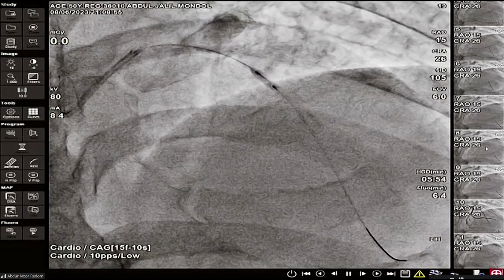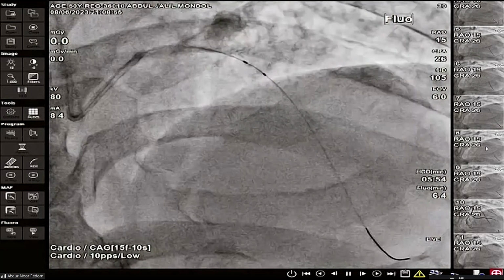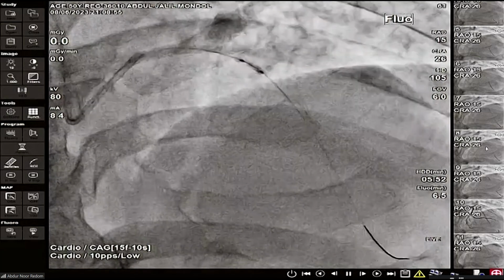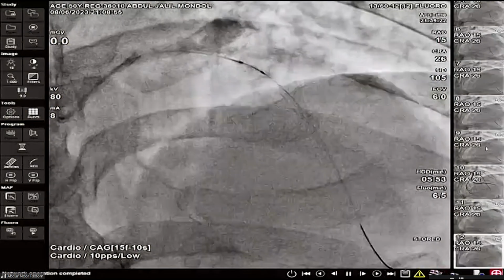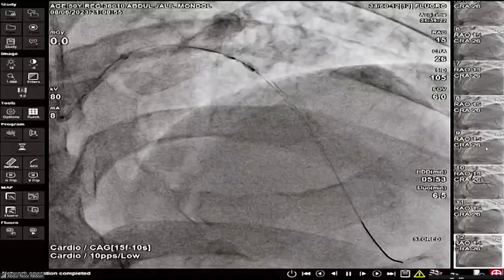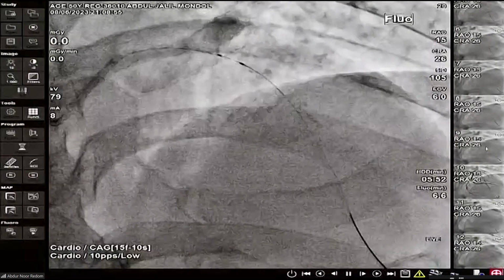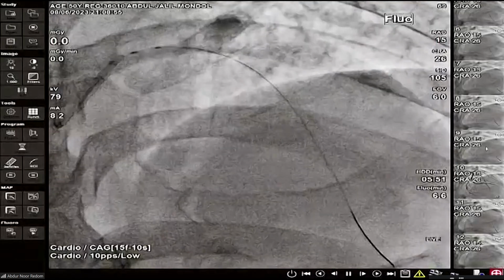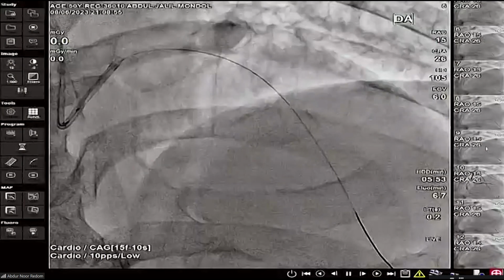Sandeep, what is your comment? My comment is about the case shown by Dr. Guzman, where the LAD looked so small and in 3 months' time it was massive. So it's a good point that these vessels are underfilled. In these cases we do DCB, treat only the proximal end with the stent, and then reassess. They come back in a few months and it'll be a much bigger vessel, positively remodeled. So when we stent at this time, we undersize the stent. Sure. Yes.